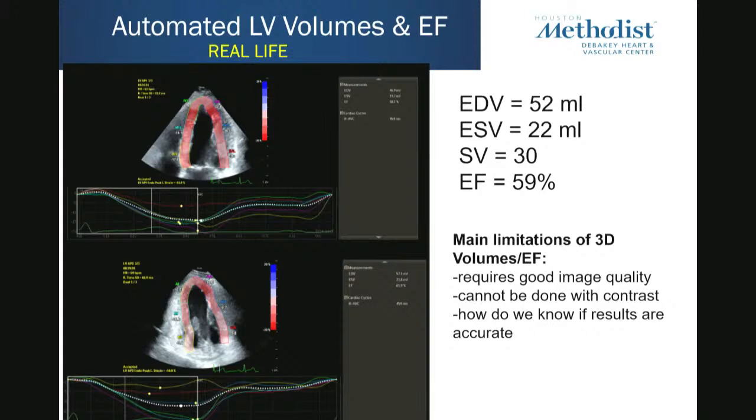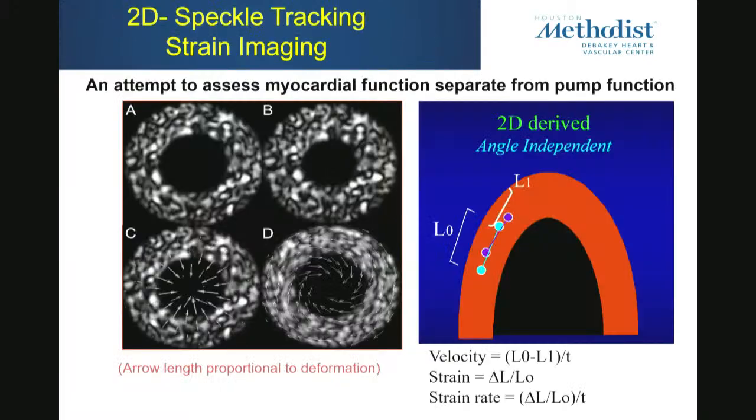And then the same thing, when you get a number, how do you know the accuracy of that number? You have to basically rely back on your experience as an estimator or do the manual measurements. Well, if you do the manual measurements, why did we even bother then with the 3D? So we still have this issue that has not yet been resolved despite 3D being around for a number of years. I think part of the problem is contouring.